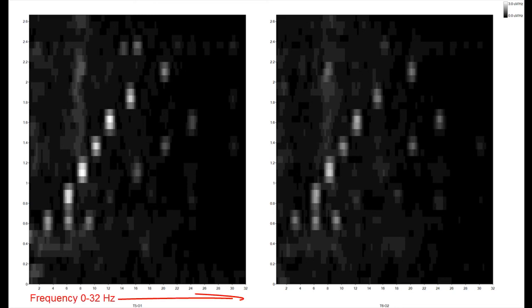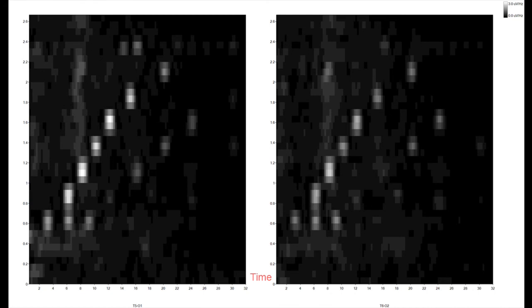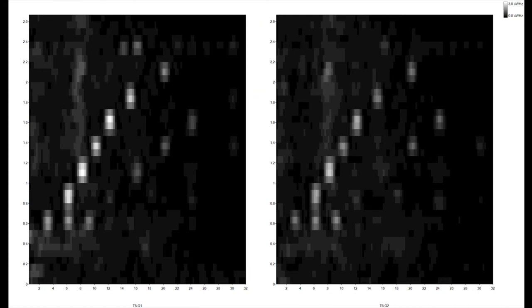Here's a DSA of the same data just shown in the CSA. Now a grayscale pixel represents the amplitude of the line that was previously shown as a vertical deflection on the z-scale. Black and dark gray shades indicate little to no amplitude at a particular frequency, whereas light grays and white indicate more amplitude, as shown on the scale at the upper right.